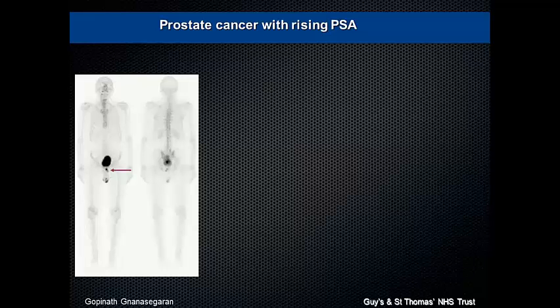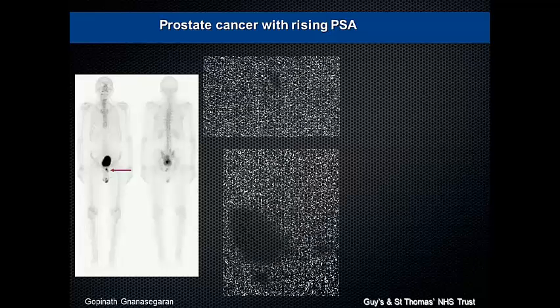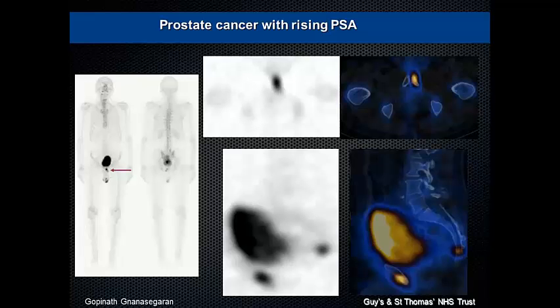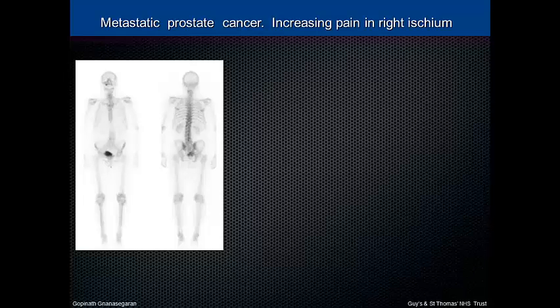Limitations of planar, especially this is a Friday evening scan. There's a focal uptake somewhere, and you know it's renal, and you know it's bladder. It could be contamination. You may say it's contamination and go home. There's a focal uptake, and I wouldn't have worried too much about it, but we did a SPECT CT, and there was a sclerotic lesion in the pubic symphysis, a definitive diagnosis of metastasis. In this case, some people would have picked it up based on how cautious they are, but a few in the early stages of bone reporting may have said, okay, anyhow, it's urinary contamination, so we could have missed bone metastasis if you don't have additional hybrid imaging.